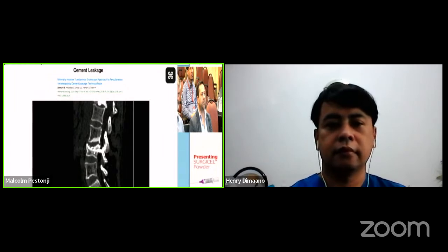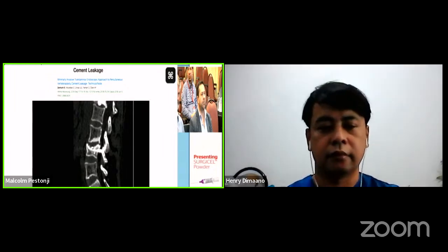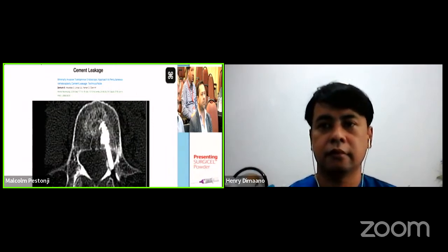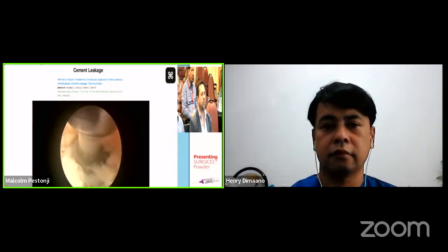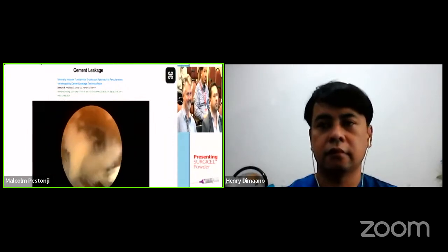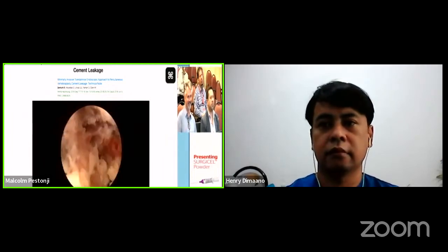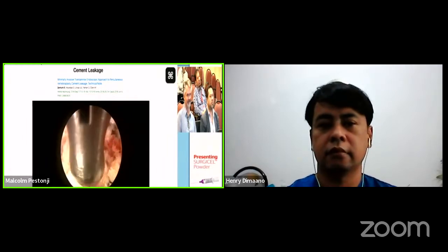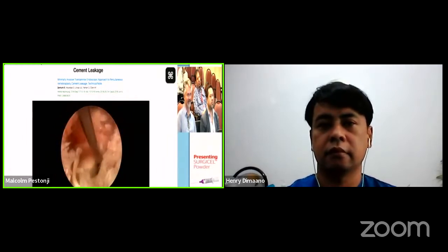The cement leakage. I published this case 4 years ago. Here there was a cement leak, and I used a translaminar approach for removing this leak. I followed the cement on X-ray.